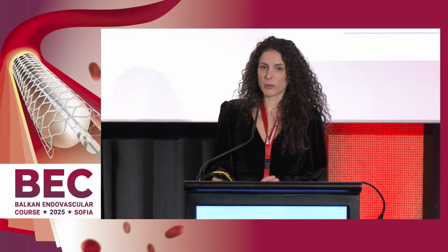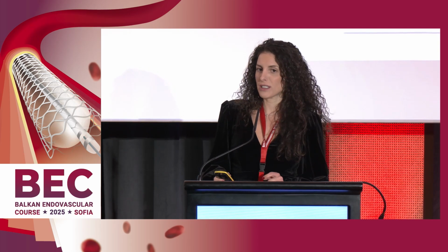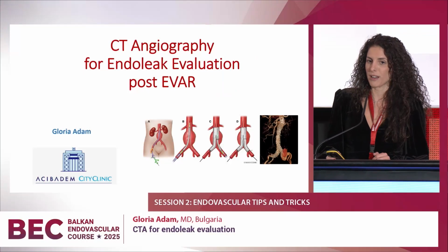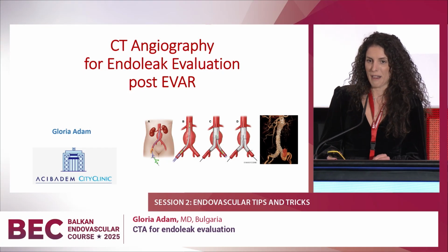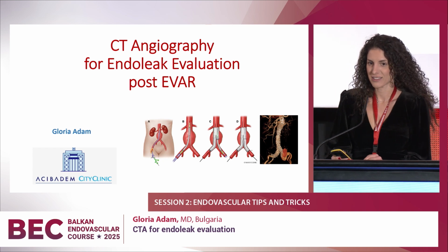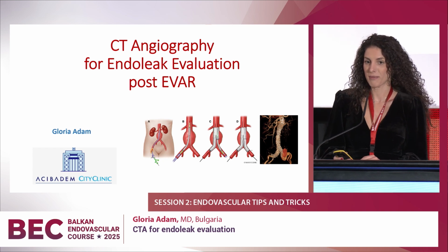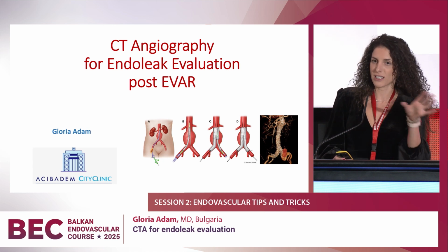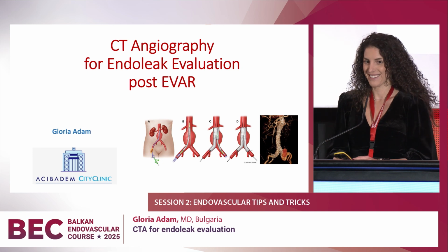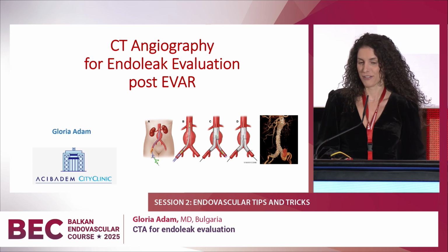And related to the previous topic, I'm not sure that in the software of the MRI we have functional MRI. About your recommendation, I'm not sure we have it. We're able to acquire the sequence and do the post-processing later. Maybe, but I don't think that they have ever done it there. I'm not in that center where Dr. Polomsky is. Okay. Yes, Philips.